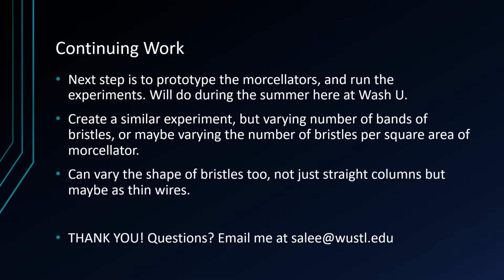Variations of this experiment are also very attractive, where we can vary, instead of the number of bristles per band, the number of bands of bristles. So that is varying laterally along a cylinder instead of radially. Another variance we could do is to change the experiment to just the number of bristles per square area of morcellator. So instead of working in 1 dimension, we work in 2 dimensions.